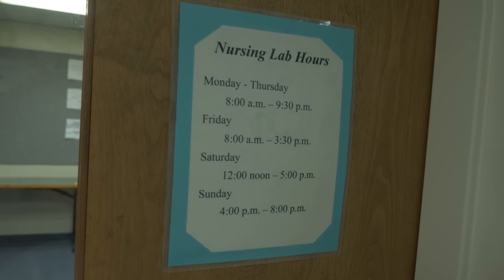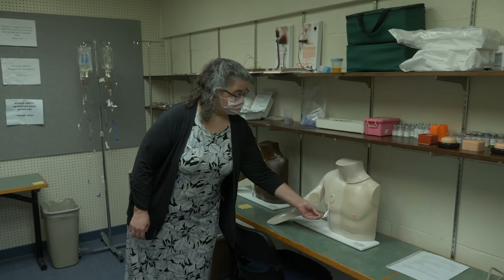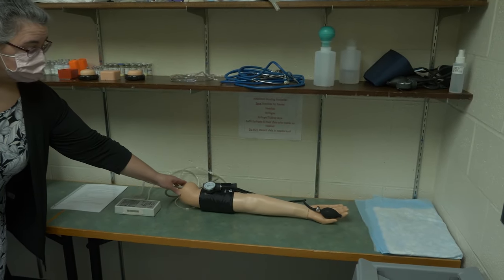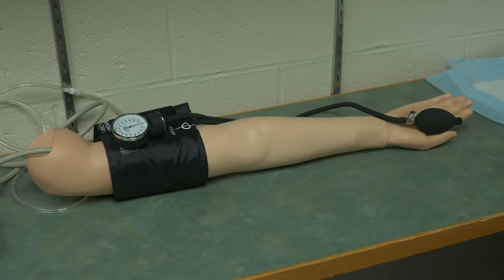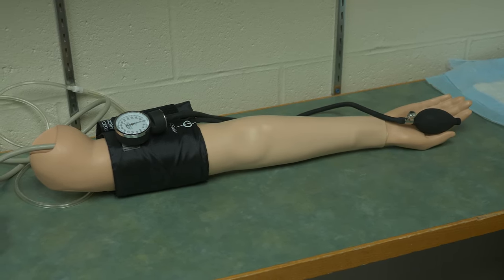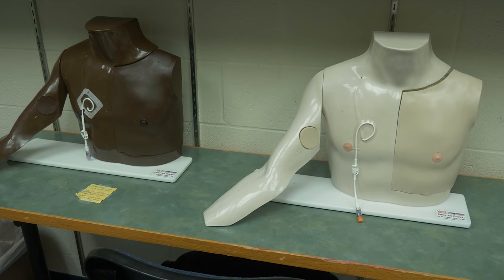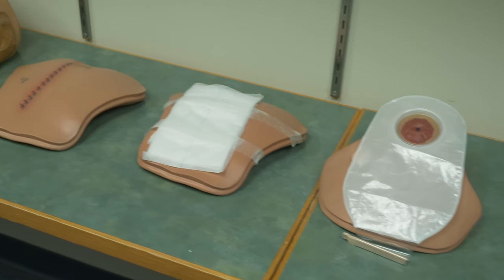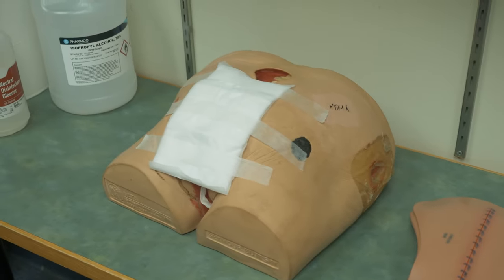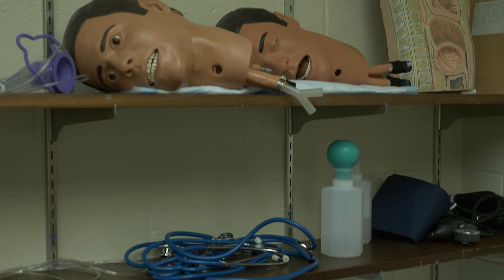We have our skills room — a practice room that is open whenever the lab is open. Students can come here to practice specific skills and work with equipment such as administering IVs, so we have IV tubing and IV sites they can practice. They can practice measuring blood pressures — this arm can actually be programmed with a blood pressure and then students can listen to see if they hear the correct reading. There are injection pads to practice injections and they can practice IV changes as well. The equipment changes according to what students are learning in class, and our lab coordinator Rachel makes sure students have the supplies and equipment to practice new skills. This room is on the smaller side, so this semester we're actually moving it to a larger room so that more students can practice at once.